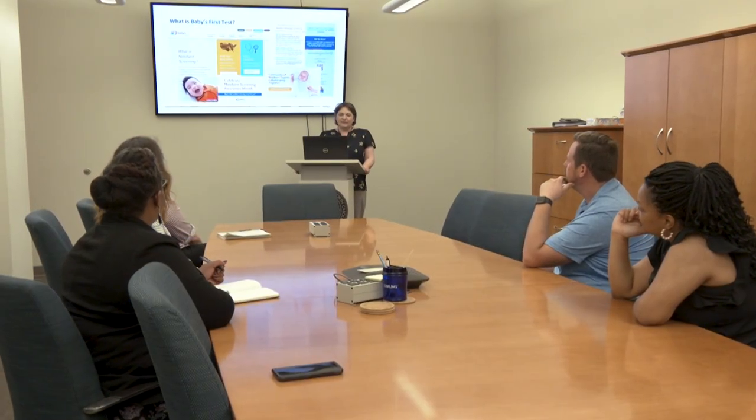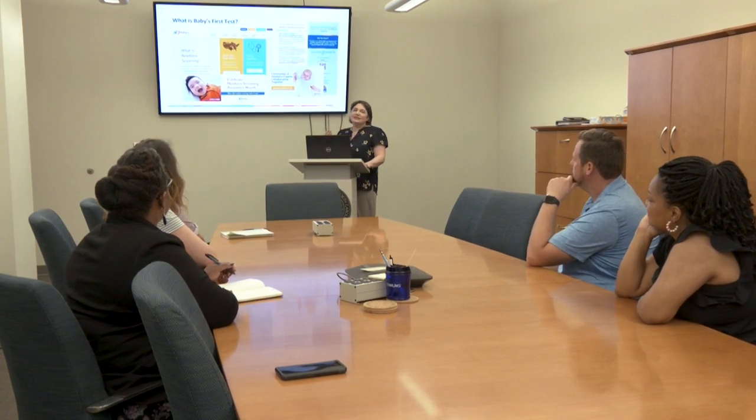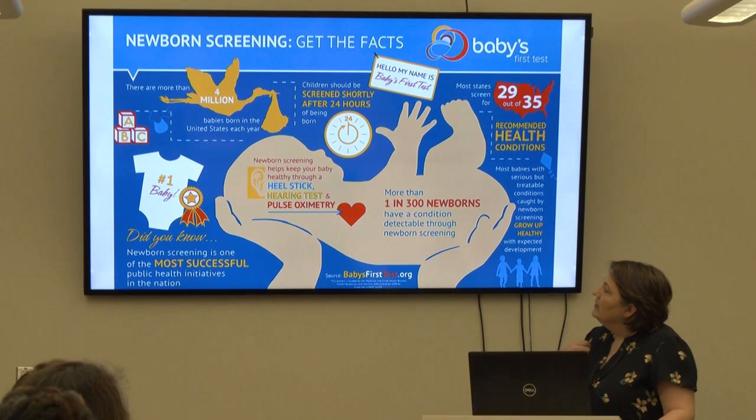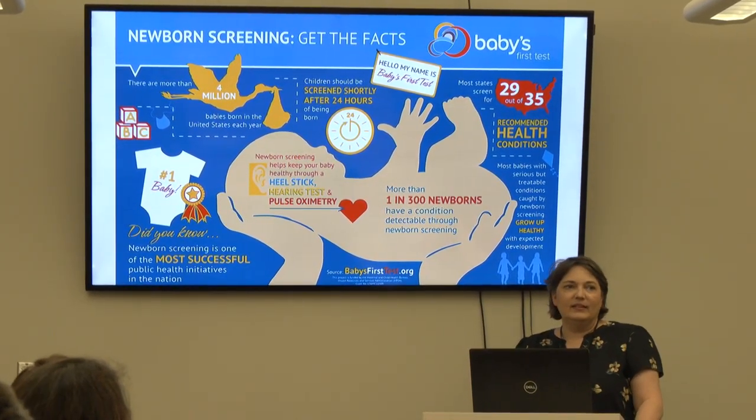Newborn blood specimens are sent to the state laboratory on a filter paper card. Shortly after birth, blood is collected by a tiny heel prick. There are approximately 120,000 babies born in North Carolina every year, so the laboratory may test hundreds of specimens per day from all over the state. When specimens first arrive at the laboratory, they are checked for quality to ensure they were properly collected for testing. Information about each specimen is entered in the laboratory's computer system, which is used for data management and results reporting.